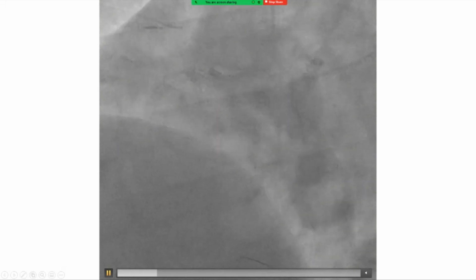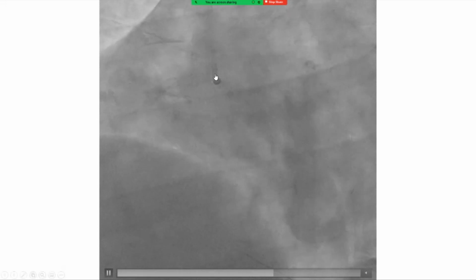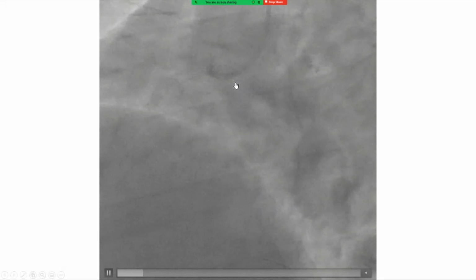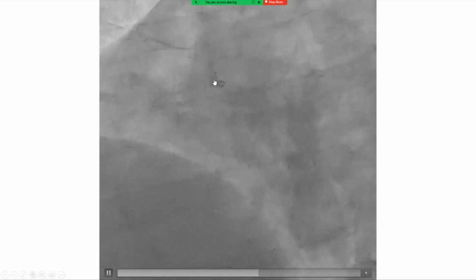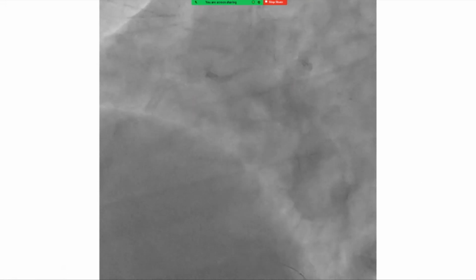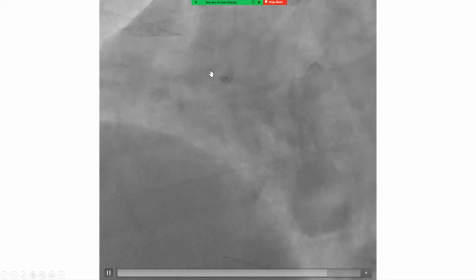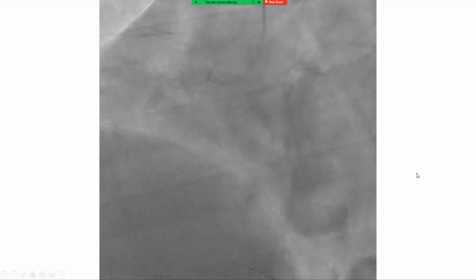This is an Ikari Left that is used almost like in a JR4 fashion, not deep in, not power position, and we're using it in a windshield wiper manner. Counterclock to get it out and clock to get it in. This is a useful technique when treating the ostium. In this particular patient, we were stenting and ballooning the ostium of the RCA.